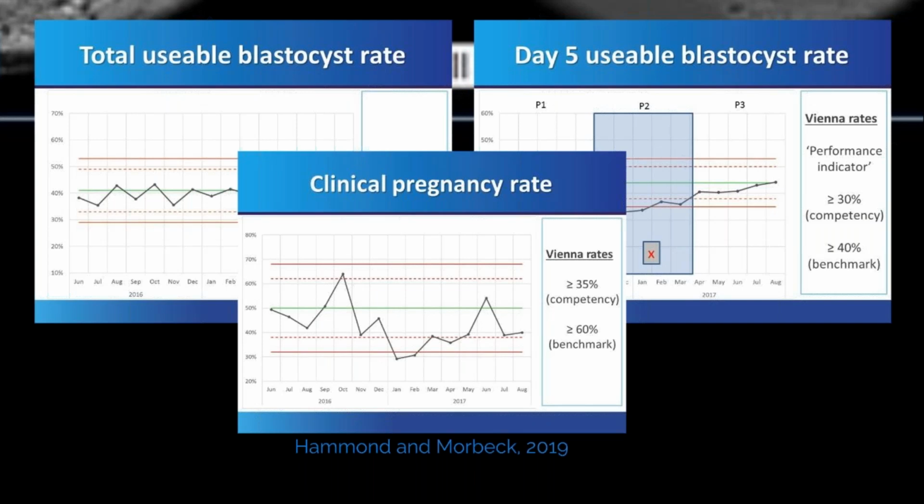Now, that's currently my favorite metric, the one that we're finding is the most sensitive. But I believe there's actually quite a few different ones that could be just as good. If you go back to the example I have from Mayo Clinic, where our percent of embryos that were more than 4 cells was different, that shows that if we were tracking a lot of data early, such as using time lapse, we could have detected a shift in our time to 2 cell or our rate of abnormal cleavages, which would have given us an even more timely measure and let us react more quickly to a shift in the conditions.